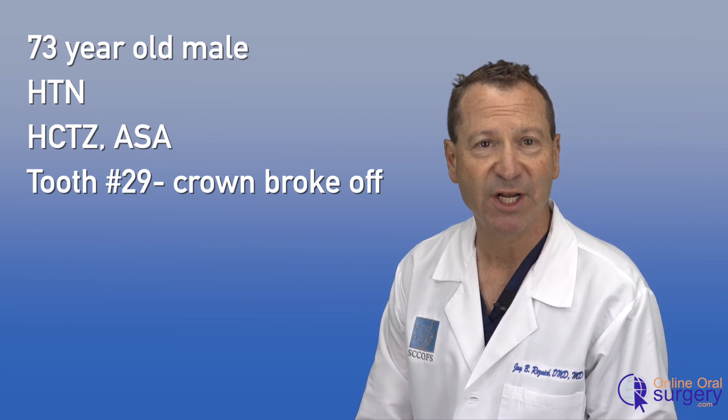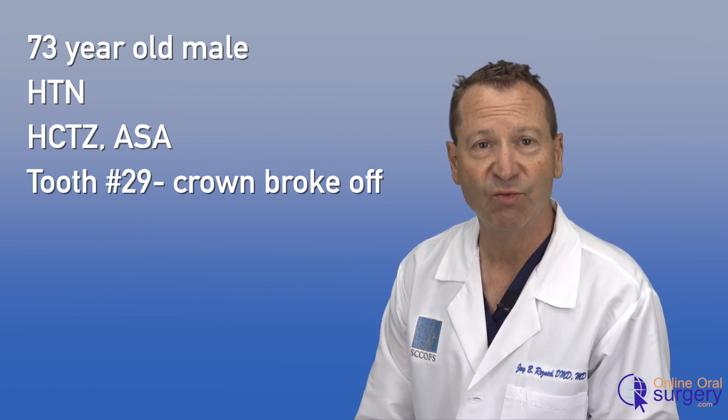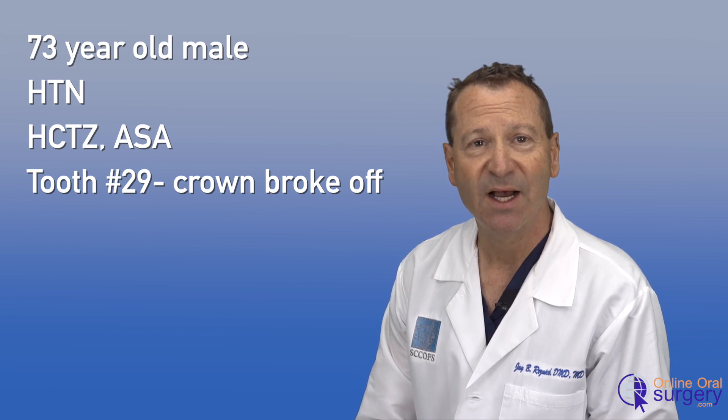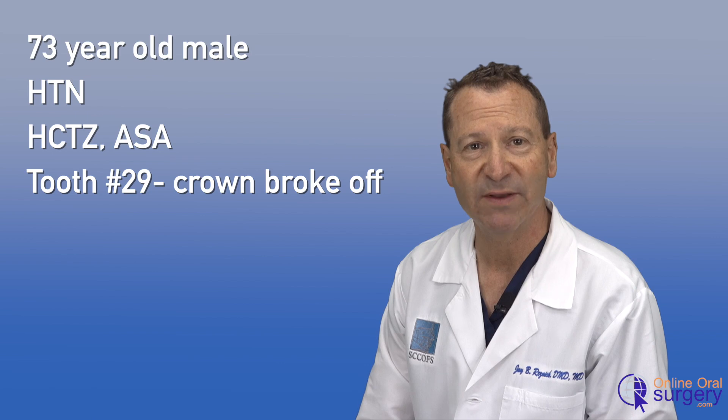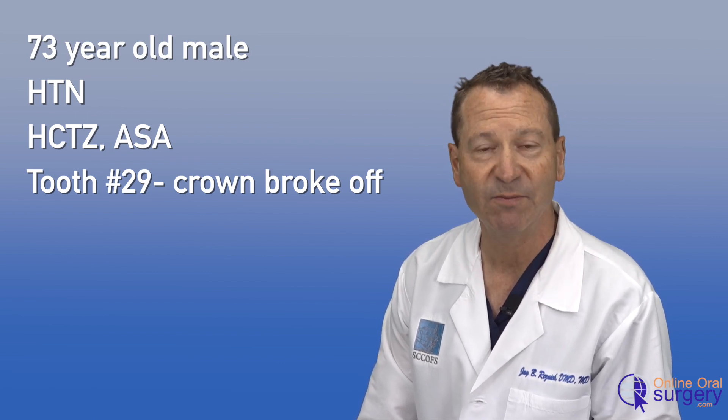In this video, we're going to take a look at a fairly straightforward case. This is a 73-year-old gentleman who was referred by his dentist for removal of the root of tooth number 29. The tooth had a PFM crown on it that broke off about a week previously, and the dentist determined that it was not restorable, so he referred him for extraction.